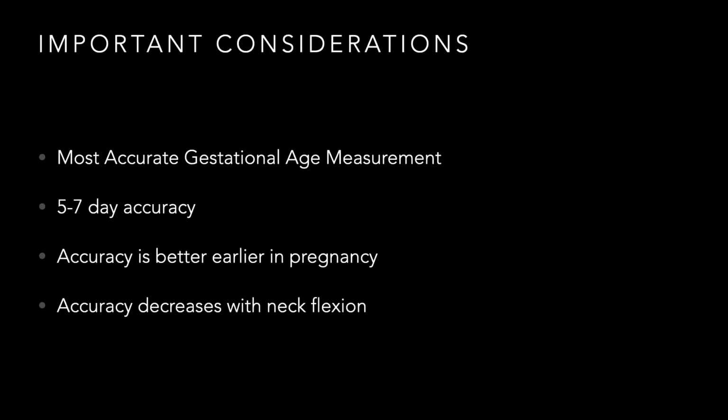In this capacity, it's the most accurate gestational age measurement, period, right? And this is coming from ACOG. OBs want to know this number, right? Early on in pregnancy, the earlier the better, right? But early in pregnancy, it is the most accurate gestational age measurement there is, right? To the point that if there is a discrepancy between ultrasound measurements and LMP-based measurements, if that discrepancy is greater than 7 days, generally OBs will defer to the ultrasound dating over the LMP dating. If they're consistent, then they may just keep the LMP dating.